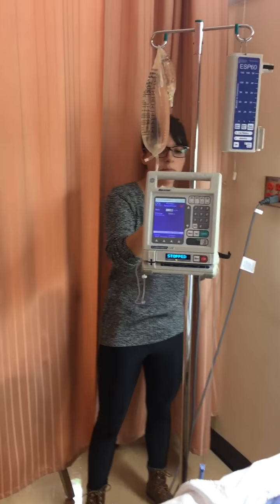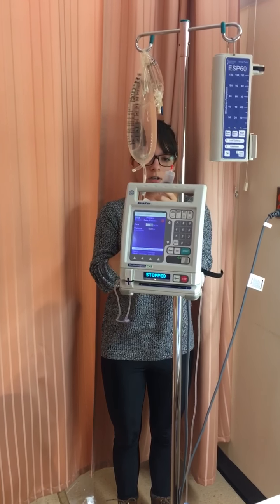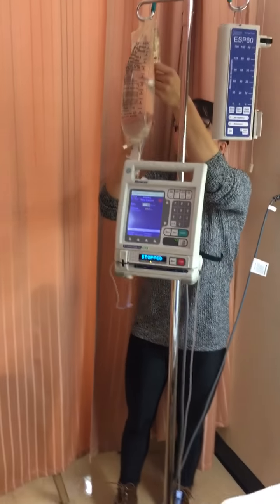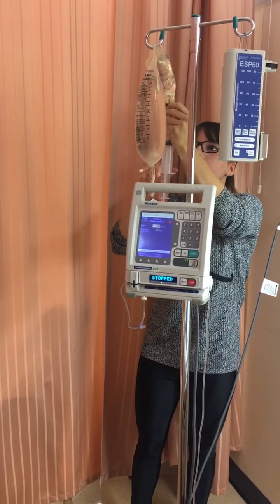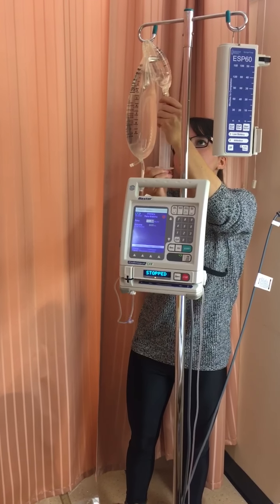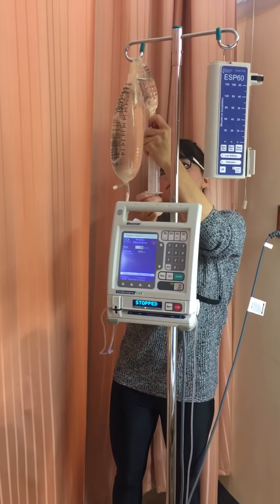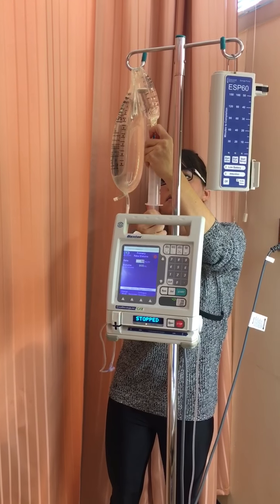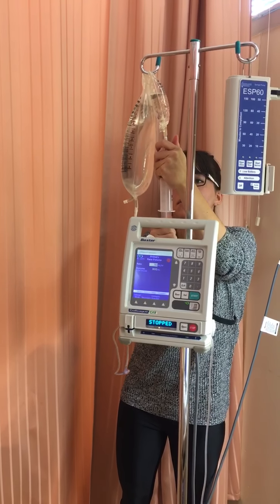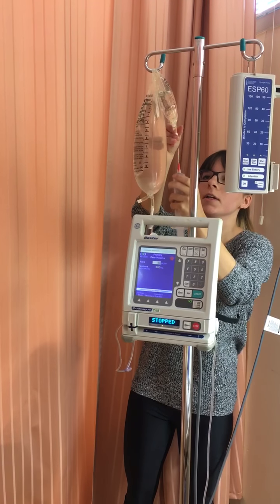Take off the needle cap, and we're going to insert 30 milliliters of air, and then withdraw 30 milliliters. Go ahead and mix that. Throughout the procedure I'll be once again making sure there are no air bubbles. Then the other rights: the right reason, the right documentation, the right education, the right evaluation. Okay, so we have 30 milliliters of normal saline.